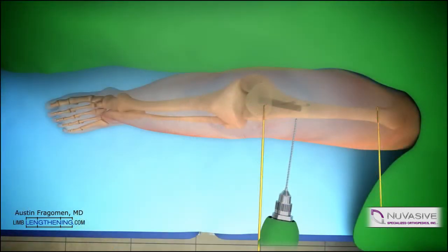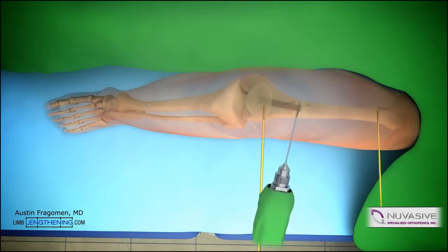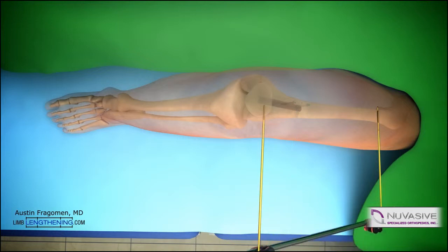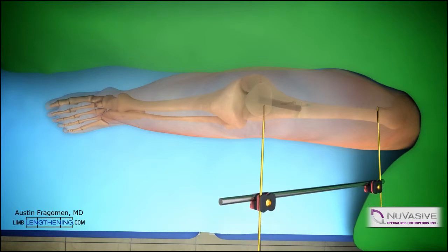The osteotomy is then performed. Multiple drill holes are created in one plane through a small incision. This is the classic corticotomy technique. These also serve as vent holes and allow for the accumulation of the reamings, which helps in the healing process. An external fixator can then be applied at this point, giving a lot of stability to the bone fragments after osteotomy.